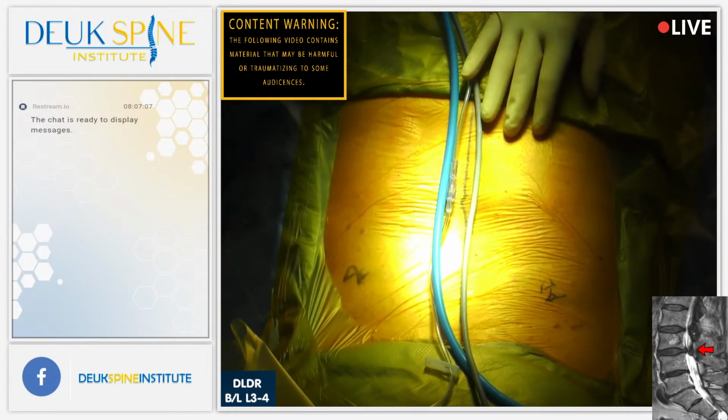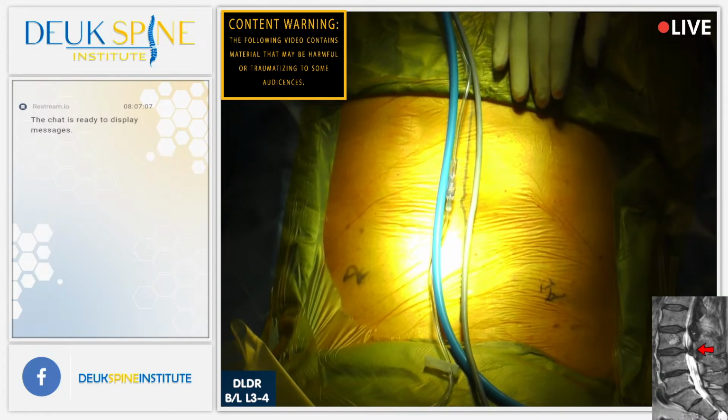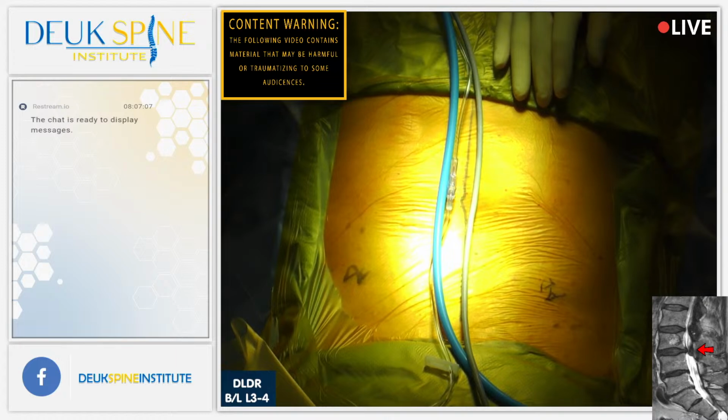Now, this patient has back pain, and the pain goes from the back into his legs. So he's got leg symptoms from pinched nerves or irritated nerves, and he's got a herniated disc at L3-4 on both sides. So we're going to go into the L3-4 and repair the annular tear where the herniation comes out of in the back of the disc. We're going to also remove the herniated disc.